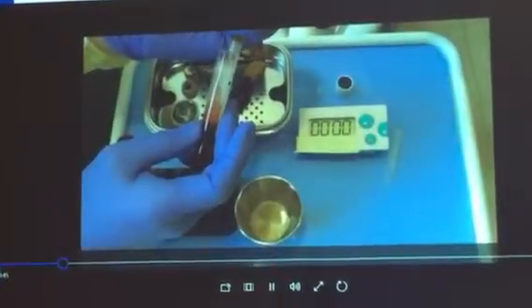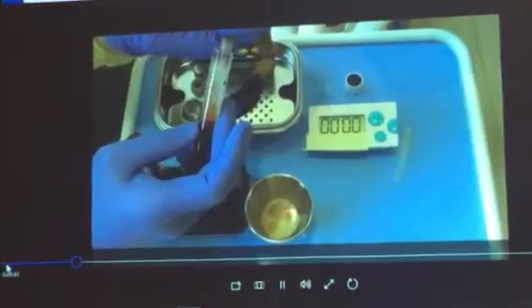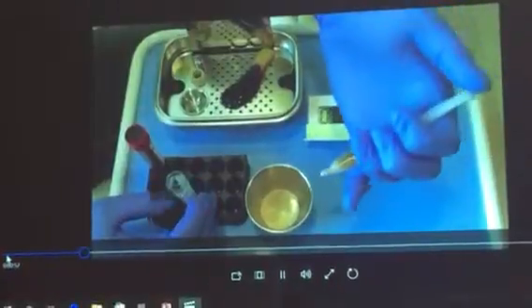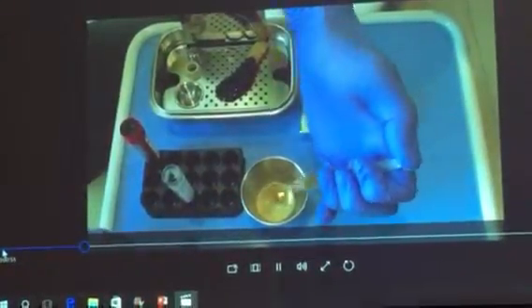I'll show you what the differences are. Here I have my bone graft. I've got a timer just to show you how long it takes for the bone to set. With the syringe we're going to express that and dump it into the container that has the dry bone.